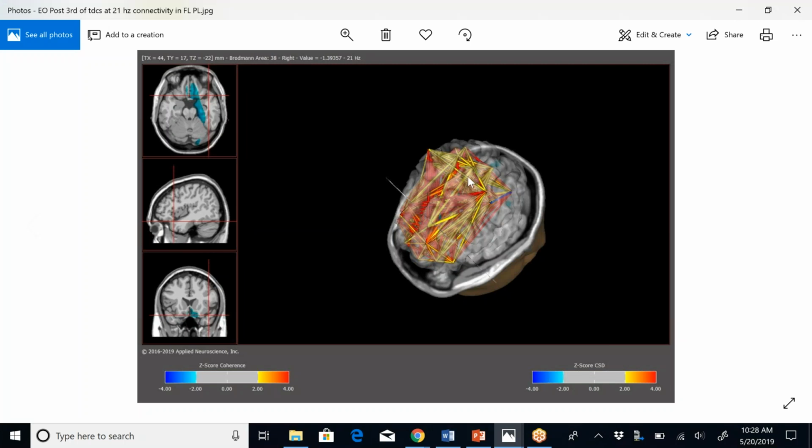So in this case, after a few rounds of treatment, the brain's capacity in this frontal parietal network went from relatively disconnected to some hyperconnectivity, to try to get these parietal lobes, which we use to process a lot of our world, to connect up to the front part of the brain to execute the appropriate responses based on the registration of this information, right?